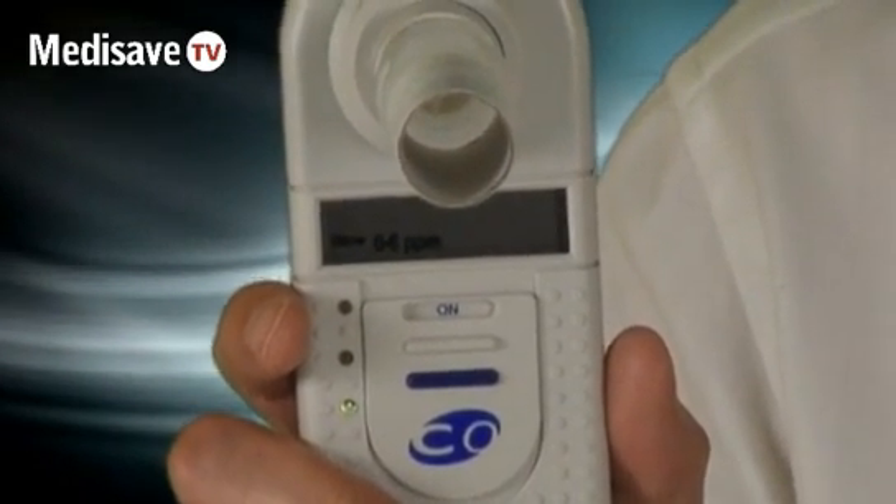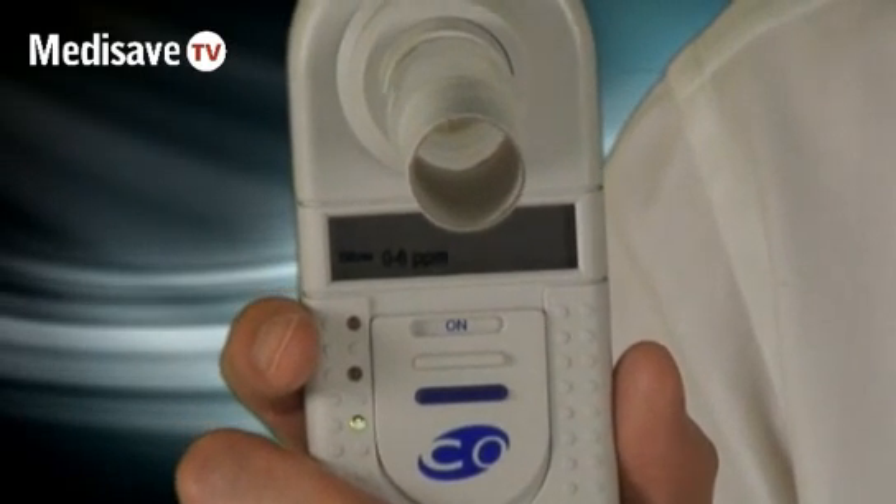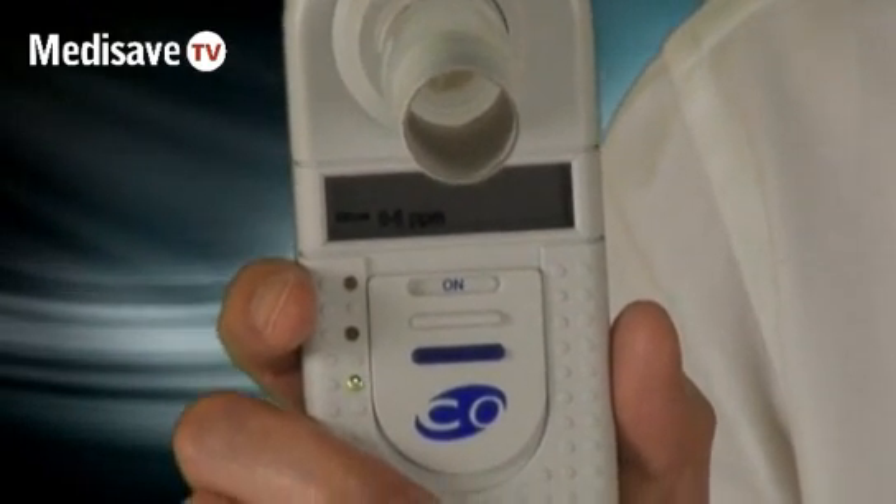As the patient stops smoking, you can use it to encourage them and they can see some positive change. If you'd like further information on this device, please contact MediSave.